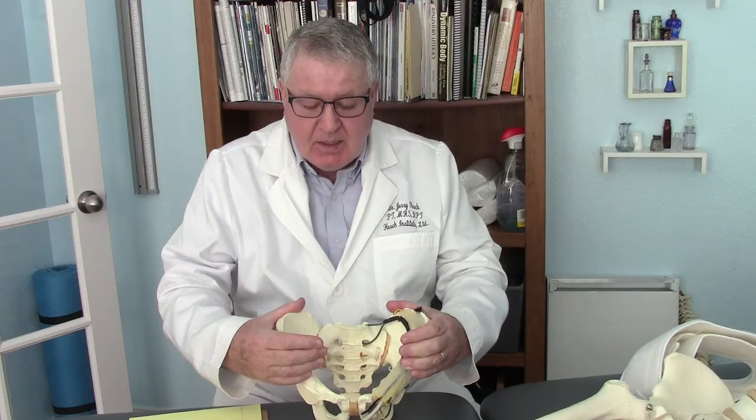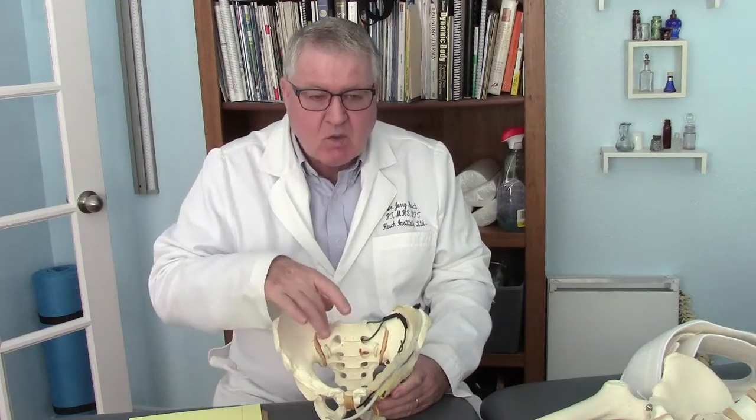There's a lot of marketing out in the community for sacroiliac supports, which are worn higher up. And again, there is much better compression when worn low. However, there are different types, different categories of sacroiliac joints, and there certainly are patients who benefit from wearing a support high and a population that benefits from wearing low. What I recommend is that we try placement at both low and high to find out what this single individual needs, rather than letting the literature completely guide us.